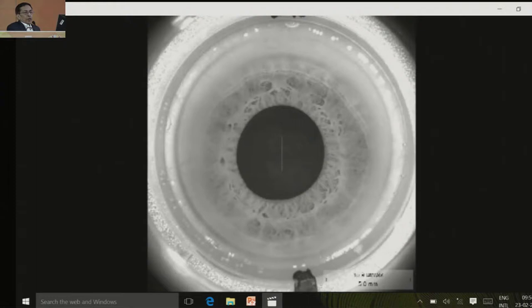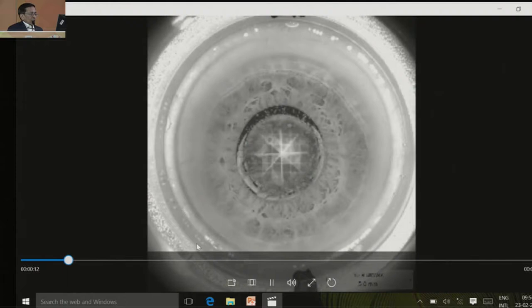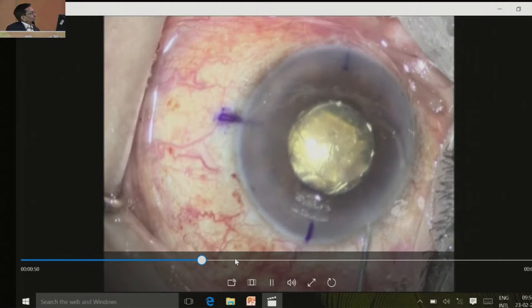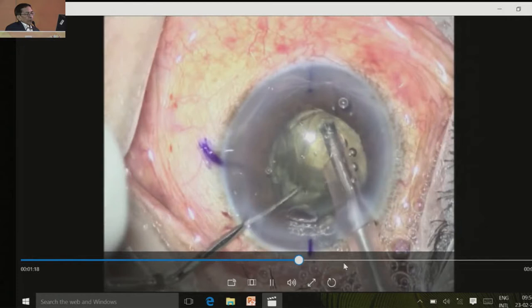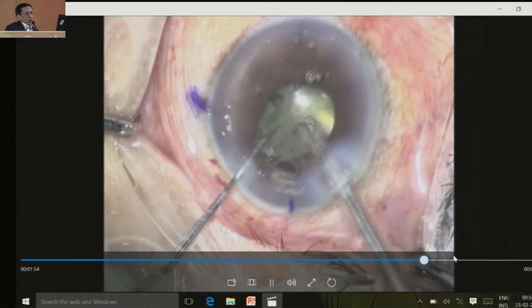One option is to use the femtosecond laser. The femtosecond laser is a recent development and there are few situations where it can be of help to us. This is the femtosecond laser, which softens the nucleus. This is a mildly dilated pupil - you can see a very central circular axis. The nucleus is cracked into multiple pieces, which reduces your energy, reduces stress on the zonules, and you can perform the surgery very well with the help of the femtosecond laser. It is not exactly necessary, but it is one of a good choice for doing a hard cataract.